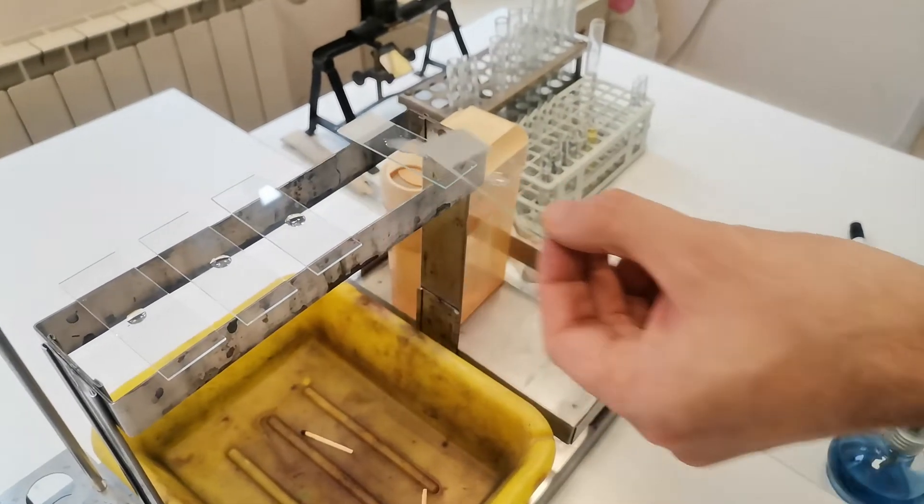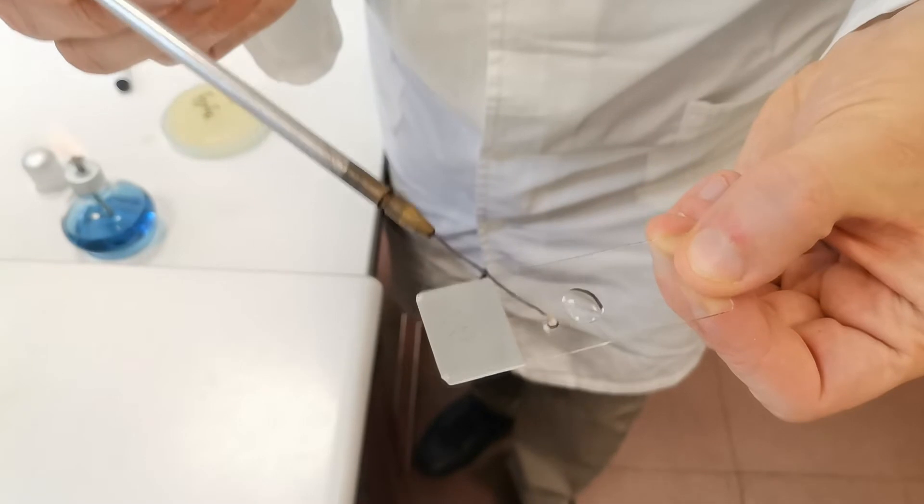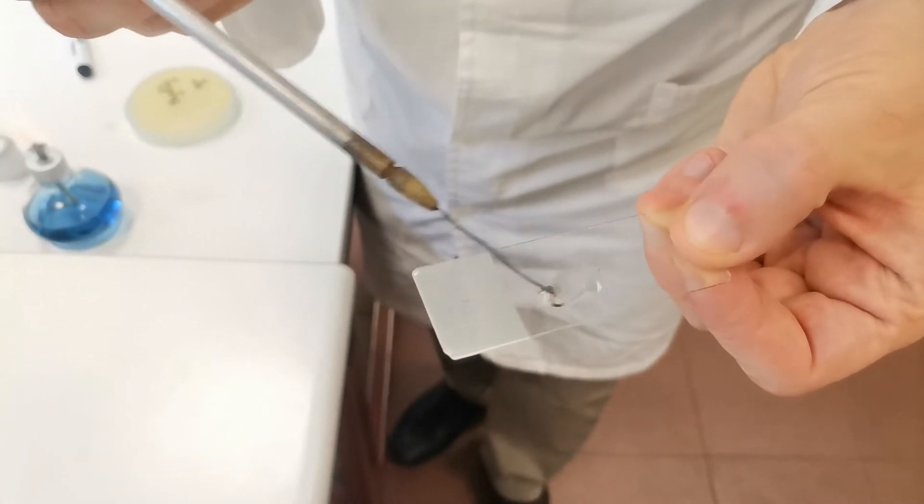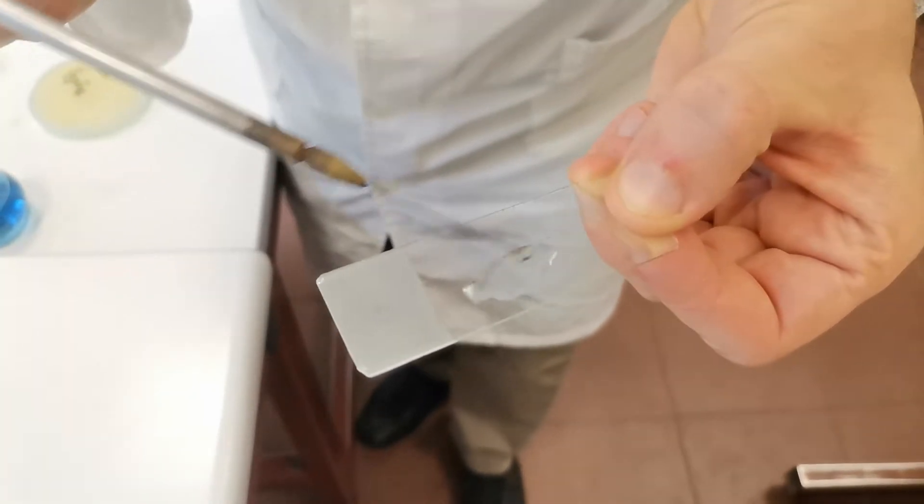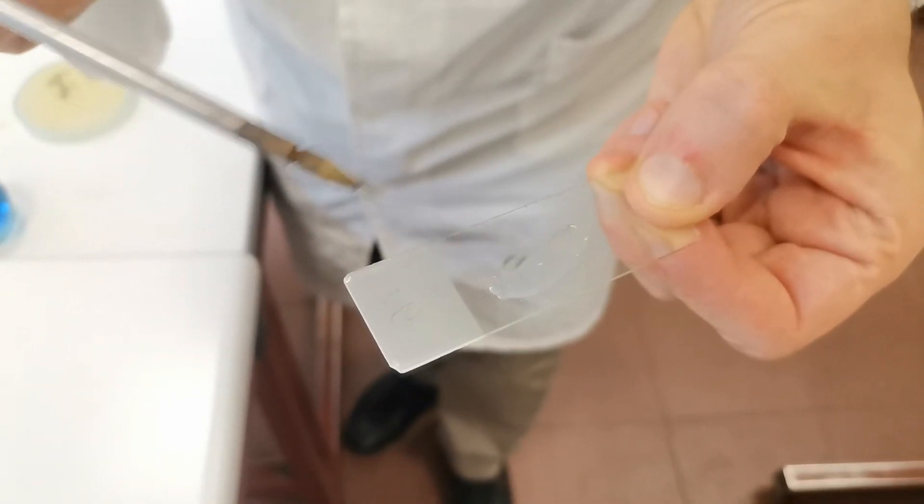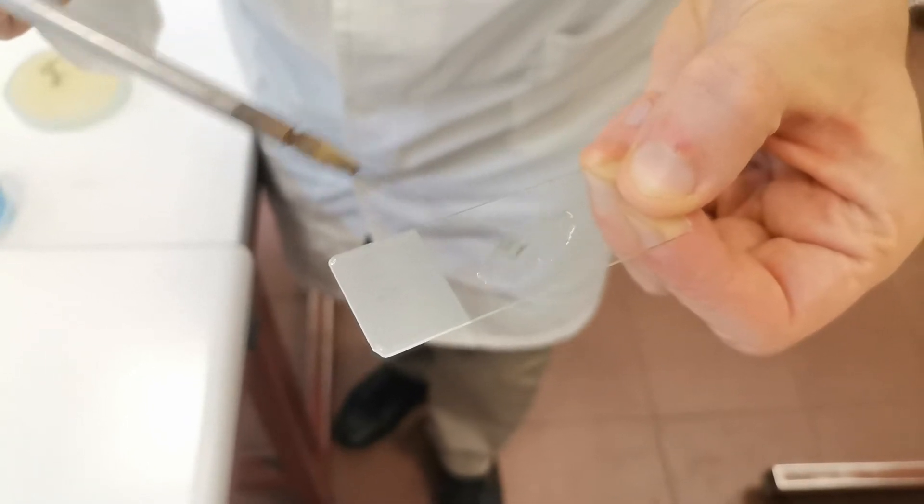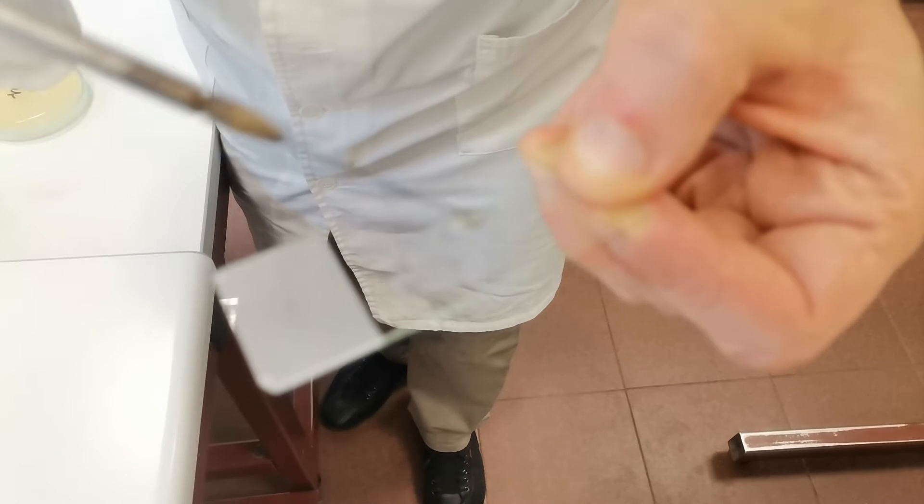This is the O111 serum. Here we place the pure culture. Gradually start mixing. I think it's obvious. Because this is the agglutination. The drop is quite clear. Probably it will become even better after a minute or so. There are fine grains.